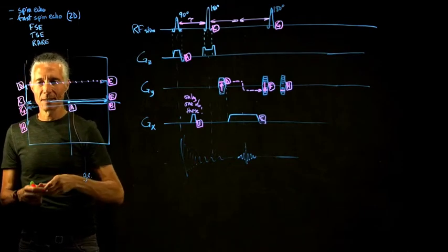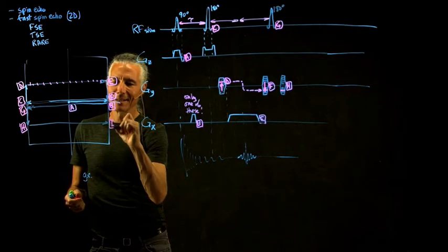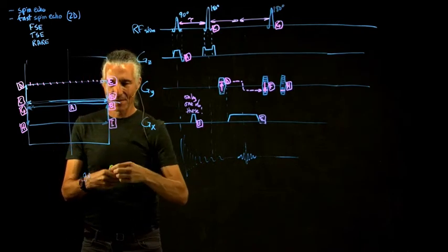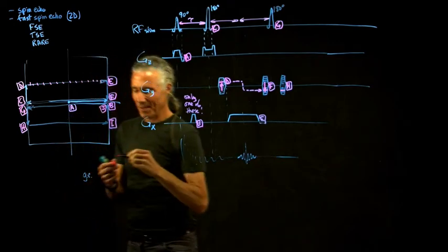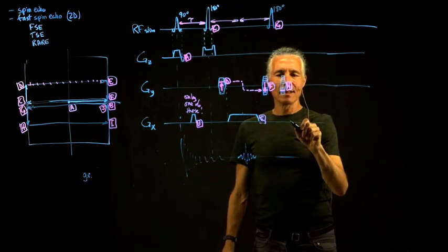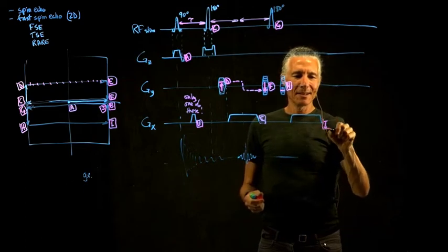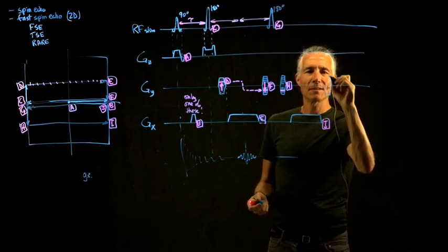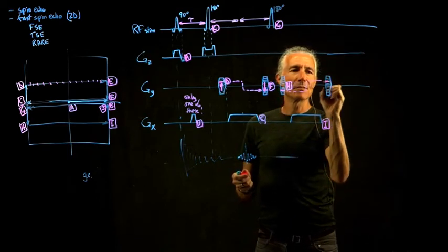And then we go across, do the readout, go across to I. And then we do the readout, then we do the phase encode fixer. So here's the fixer for this one, which is going to be positive instead of negative, and that will be J. So now we're ready to repeat. Okay, so we did GH, and then we did the readout. And at the end of the readout, we were at I, and then we have to do another version of the fixer phase encode, but in this case we do the opposite again, so we use that one.